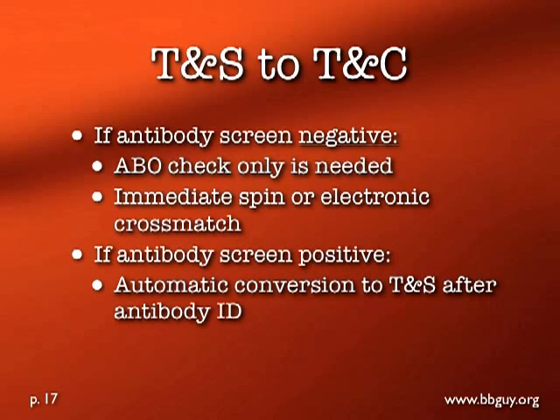So you will determine what the antibody is, get antigen negative units ready. Obviously, that'll usually entail some communication between yourself and the clinician. And it's important to have that communication. Again, you can reassure them that we know how to handle this process.